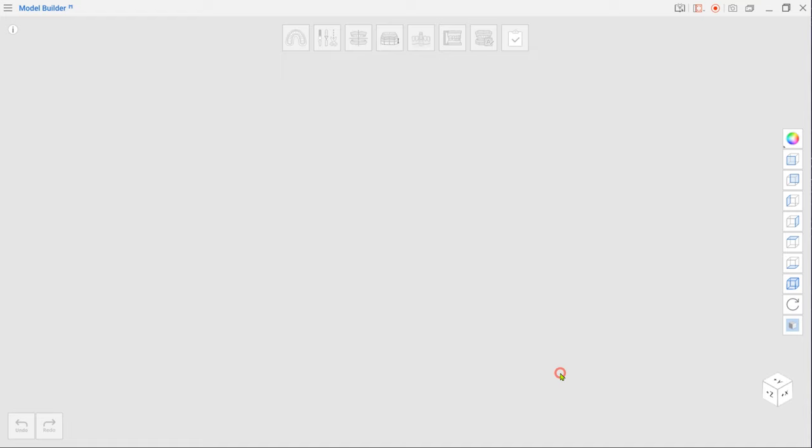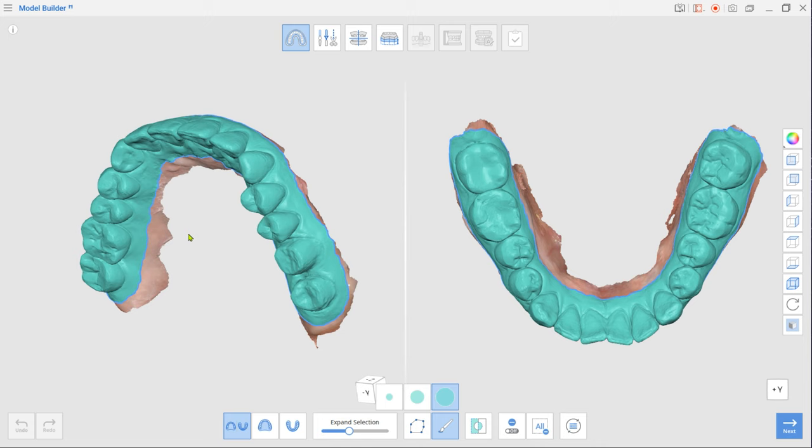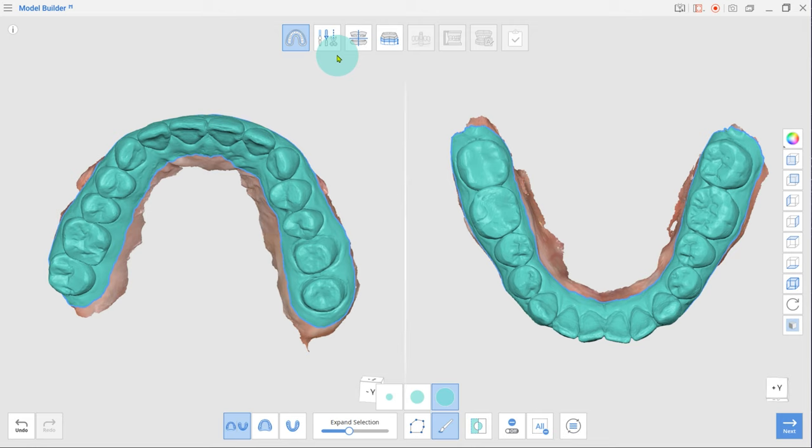First, enter Area Designation Mode. Enlarge selected areas using the Expand Selection slider. Left out parts can be selected with brush selection.